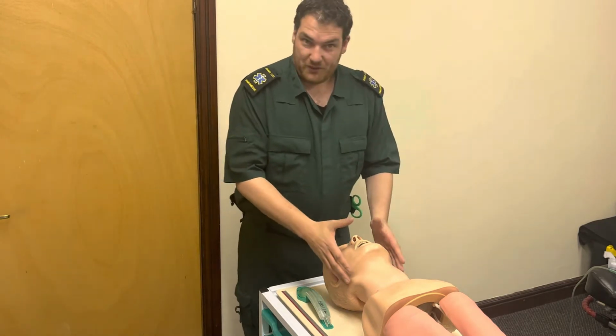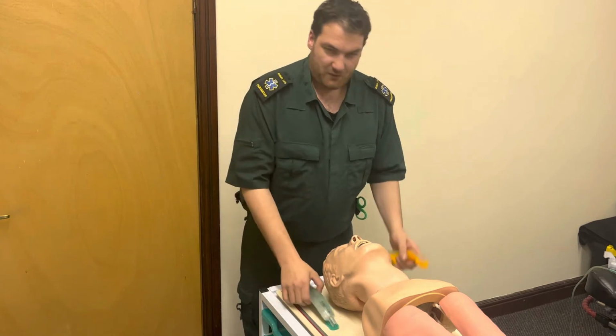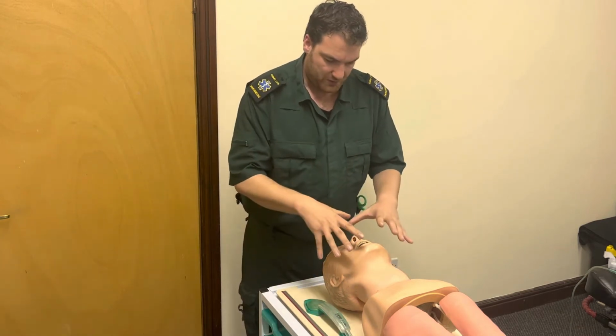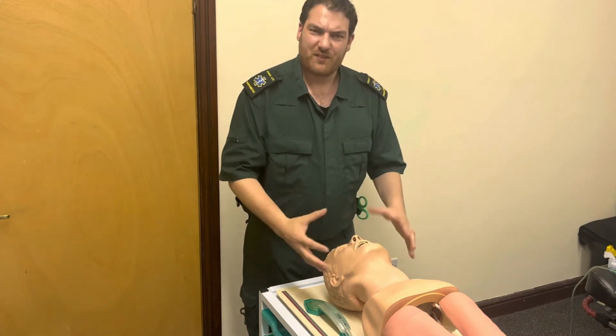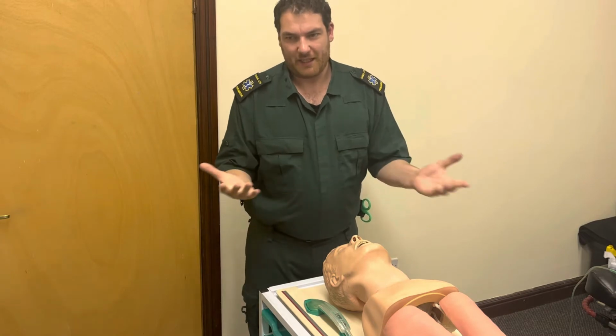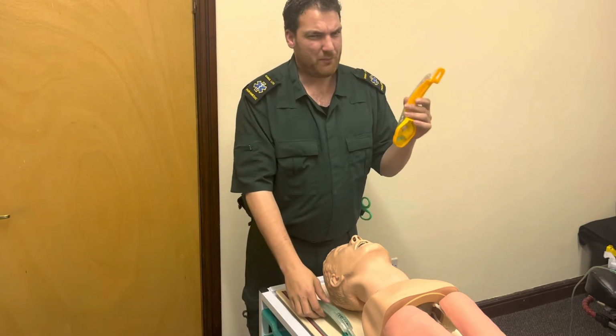Now when you've got a person, usually we've got the guideline of the sizes and the weight, but what we do is we also look at the skull, how that forms. If it's a really big head, it's usually going to be a big airway, and that's a good indication that you might need a bigger size, so be mindful of that.